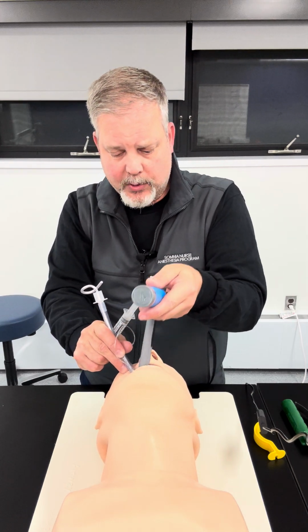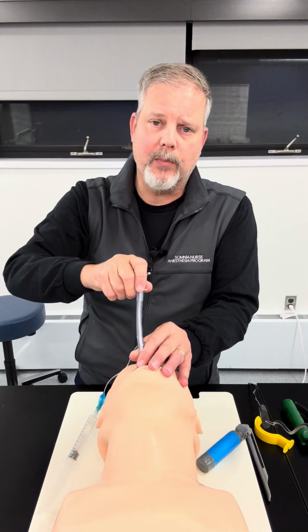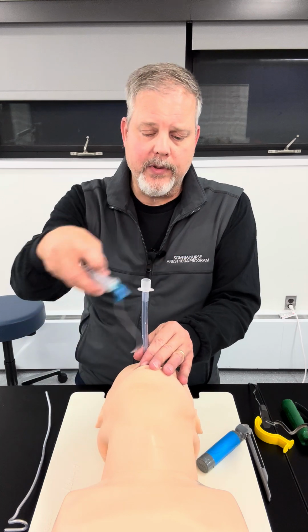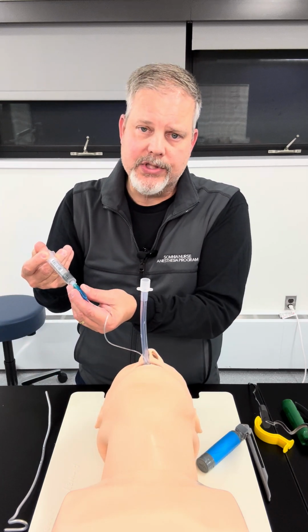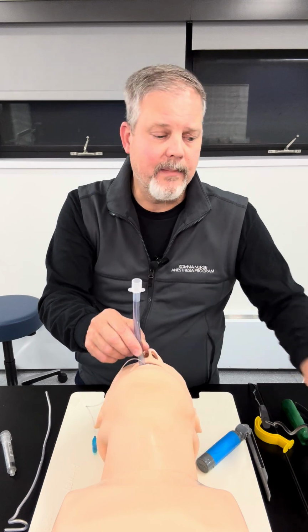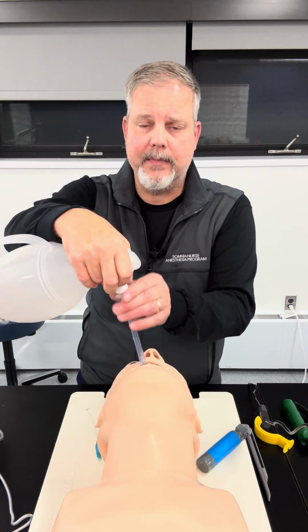I'm going to gently pull my blade out while holding the endotracheal tube. I'm going to pull my stylet, and I'm securing the tube so that when I pull my stylet, I don't also pull my endotracheal tube out. I'm going to then inflate the pilot balloon, which is going to inflate the cuff. The cuff is right below the vocal cord, so now this is preventing it from coming out at this point in time.